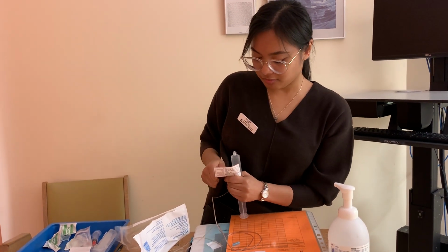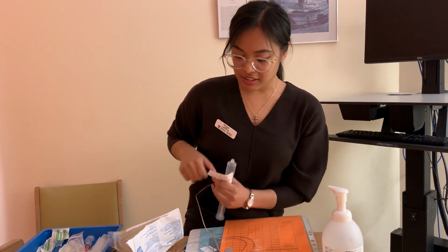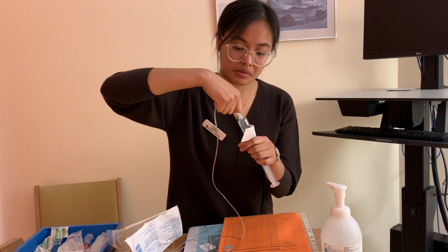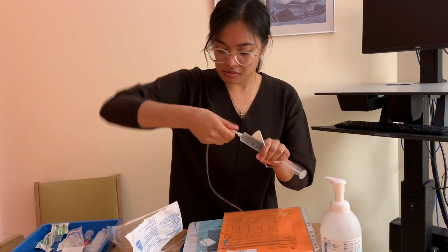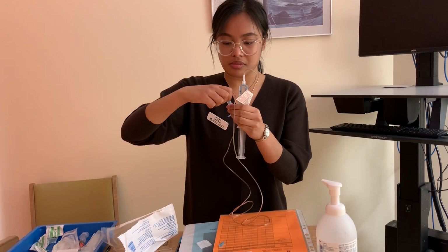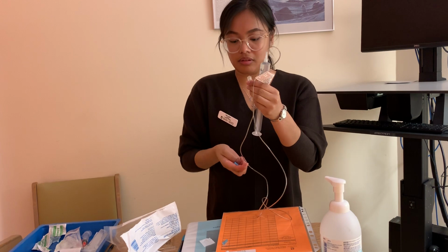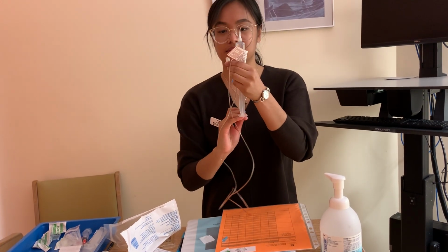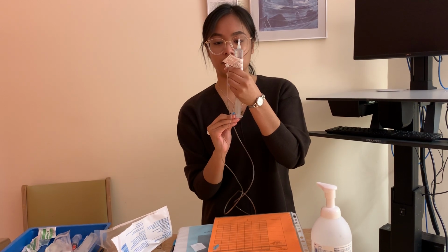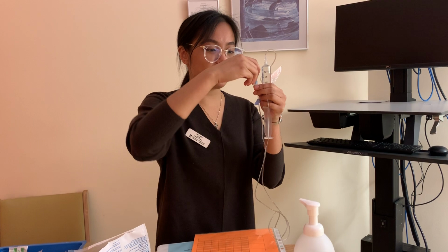So I'm going to be checking with this vial since it is full. Okay, maintaining sterility. I'm going to hold this. 40 milligrams. So this is 10 milligrams. So that works. Okay, and with this one, I'm going to forward prime. I'm going to make sure that there's a bleb. I'm not touching this. Okay. Carefully. I see the bleb. One bleb. Awesome. I'm going to recap it.